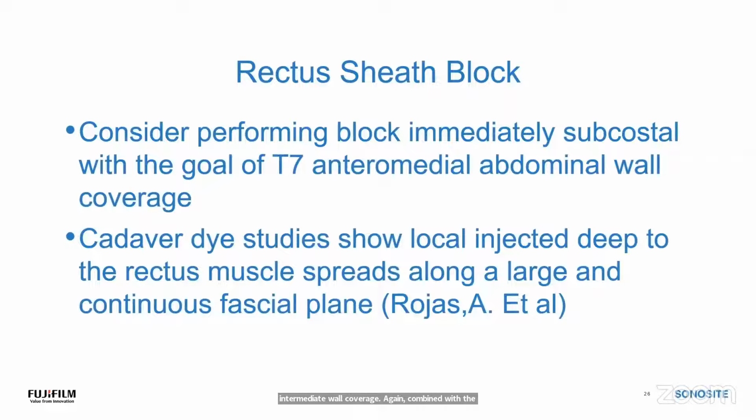Interestingly enough, there are cadaver dye studies. When you inject the recti at that level, the local anesthetic will spread along that sheath, will spread caudally. So you'll get great coverage depending on the amount of volume that you inject. They've done dye studies to prove that, and we see it in our incisional coverage every time we do these blocks. So even if a laparoscopic procedure is converted to open, we'll get really good coverage of that midline incision. So I'm very confident, anecdotally, that these blocks work really well for perioperative pain relief.